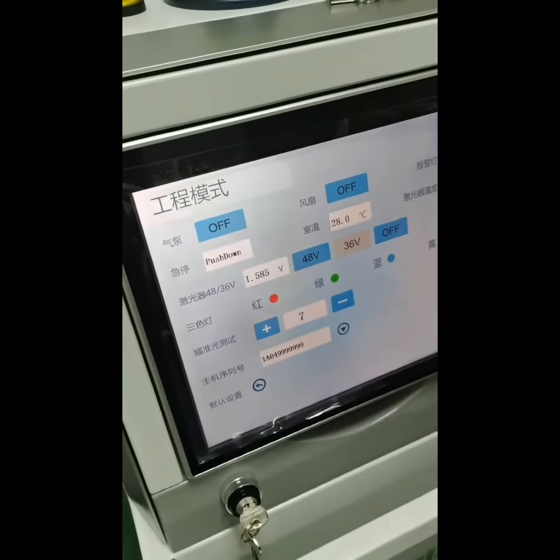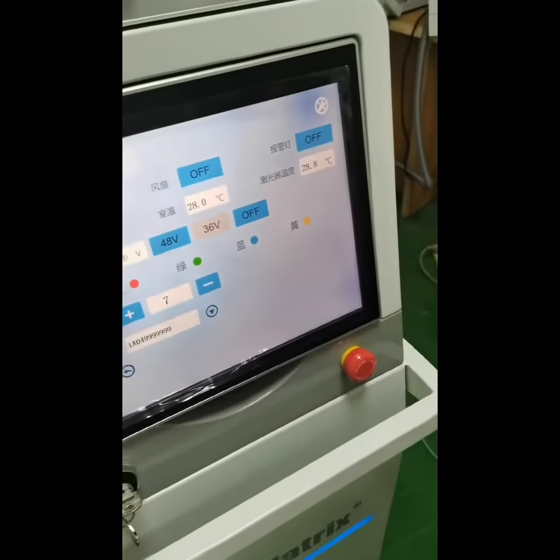Press the emergency button — it will go off. Then release the emergency button.